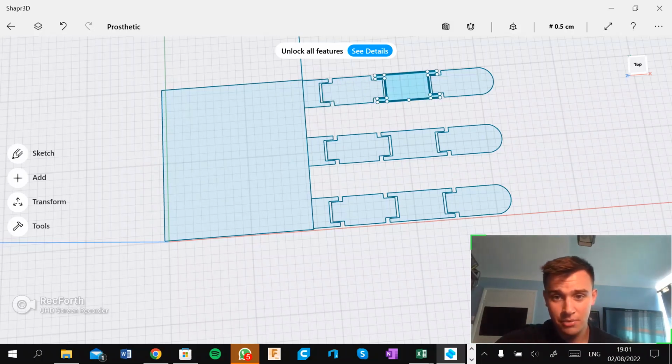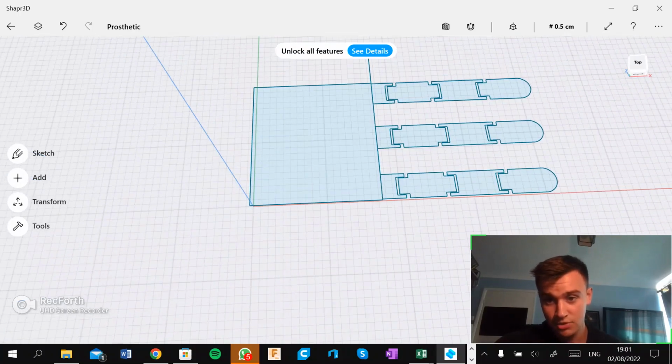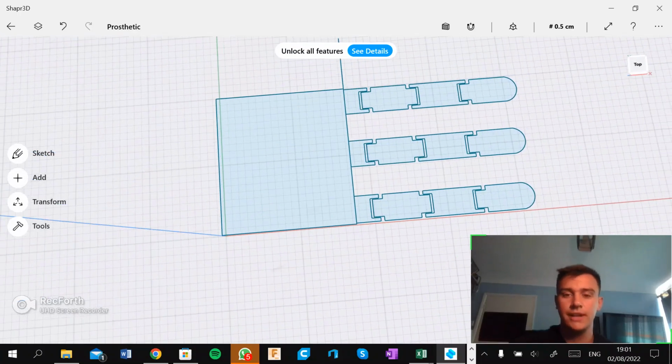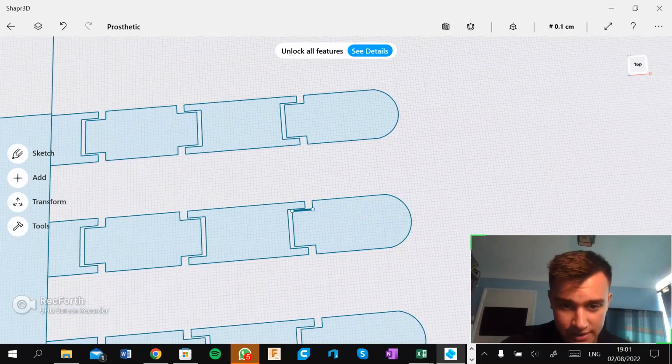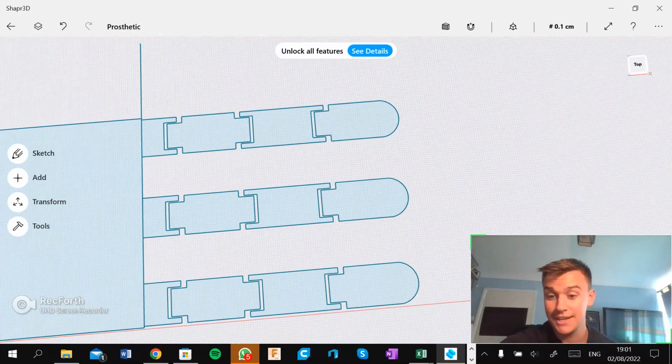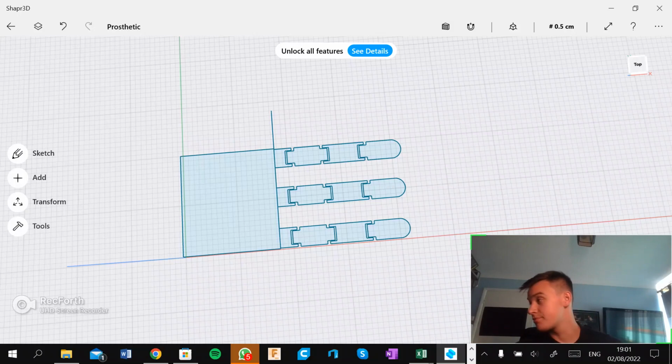So at the moment, you can see we've got 3 points of movement along there, there, and there. And so what I plan on doing is extruding all of these up to begin with, just to try and get the main fingers done. And then incorporating some circular designs along there, so it actually hooks in like a hinge. And then I'll start building the thumb, and then see where I go from there. I'll be printing off some prototypes from a printer there. I'm operating on the Ender 3 Pro, which has always served me quite well, and it's been a massive help getting into engineering, this kind of thing.